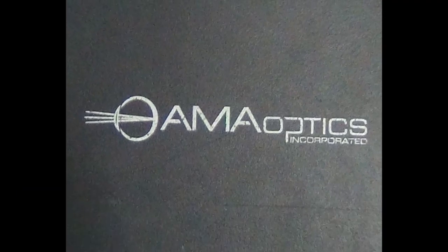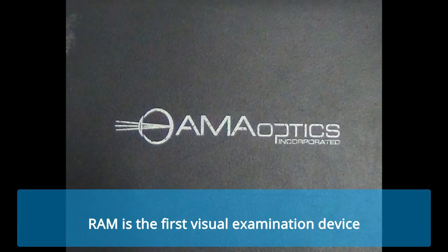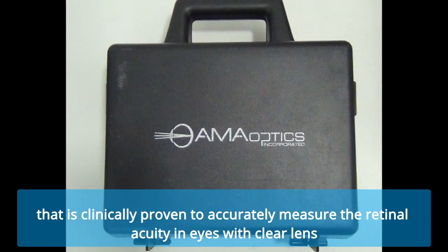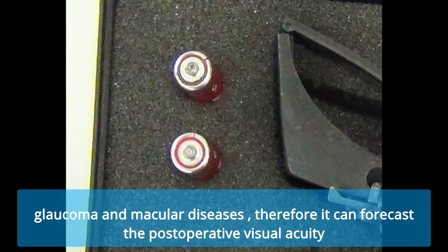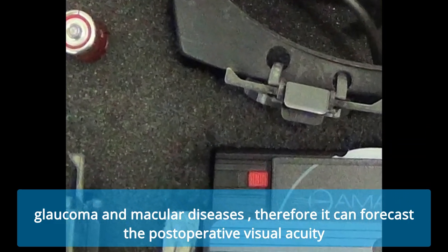Retinal acuity meter, which is called the RAM. RAM is the first visual examination device that is clinically proven to accurately measure the retinal acuity in eyes with clear lens, cataracts, cloudy posterior capsules, glaucoma and macular diseases, and therefore it forecasts the post-operative visual acuity.